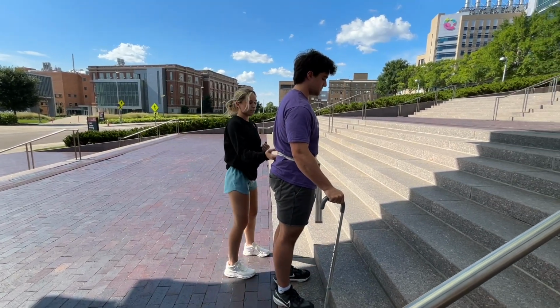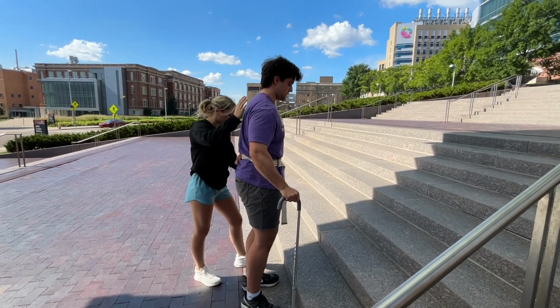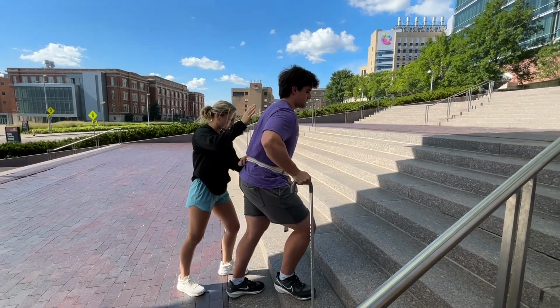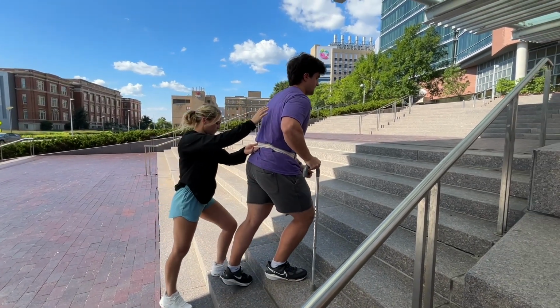When walking upstairs with a cane, patients should place their stronger or uninvolved limb on the elevated stair and lift the body while raising the weaker leg and placing the cane on the stair for stability. The cane should be on the side of the stronger limb.